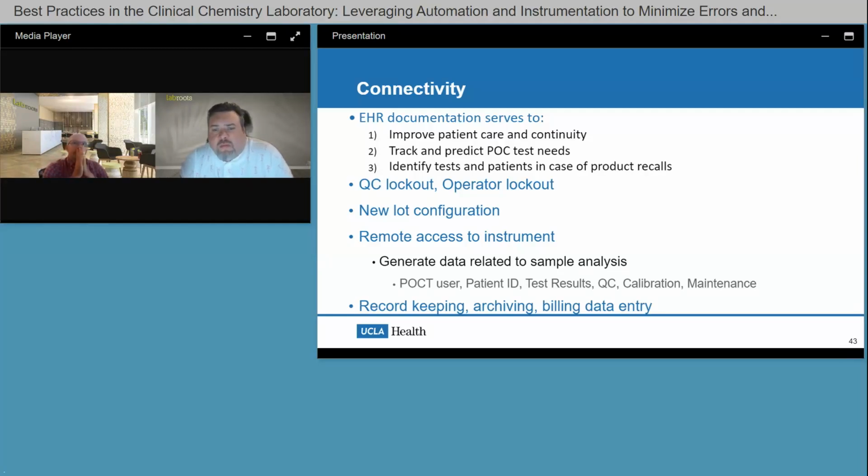Yeah, I think I have seen a greater demand in infectious disease testing. And with that, I want to stress that one major driver of that is the availability of some vendors and technology, again, improving and offering PCR tests for infectious disease testing, which are rapid, have that increased accuracy versus the traditional old antigen testing, and offer very quick times. So I think there's a great demand there.